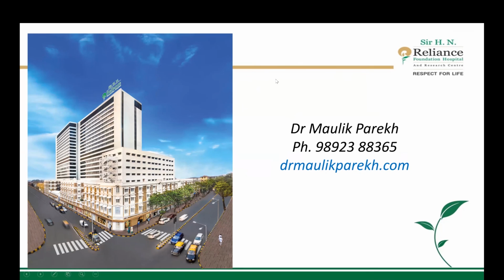So is there any coronary problem? No, till date, we have not faced a coronary issue. We have had to use coronary protection for a couple of cases and also do a chimney procedure for one of my patients, who was obviously high-risk, but have not had any coronary occlusion till date, touch wood. Coronary occlusion on table is almost certainly fatal, because after TAVI valve deployment there is no way that an occluded coronary can be recannulated and salvaged, unless God is really with you.